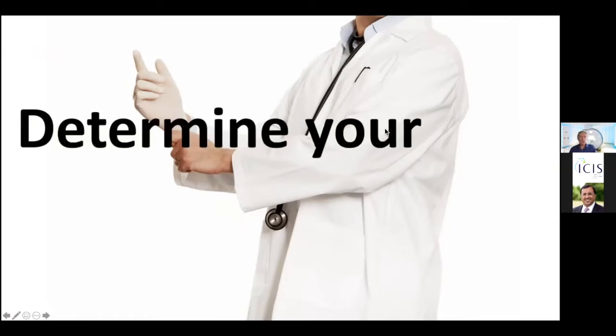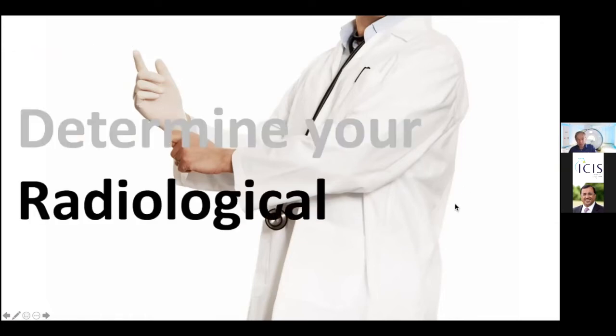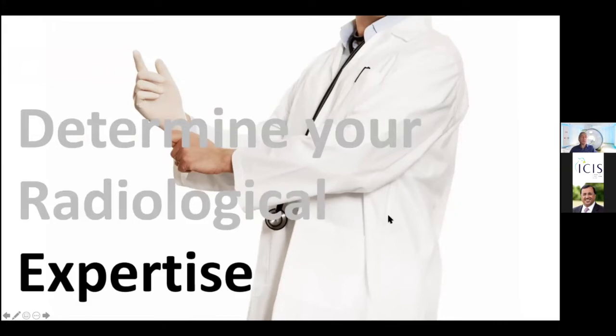Determine your radiological expertise. If you consider not using contrast, I have some advice: look at the images without contrast, write down your diagnosis, then look at the images with contrast and write down your diagnosis.